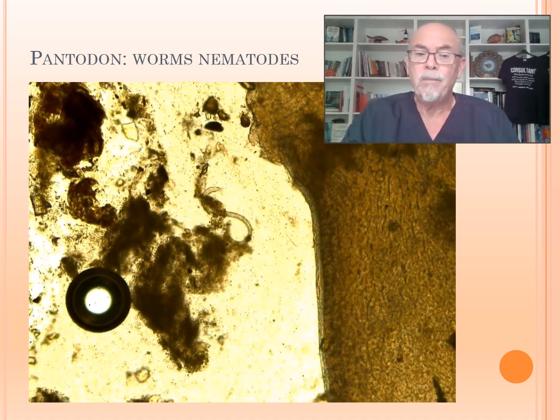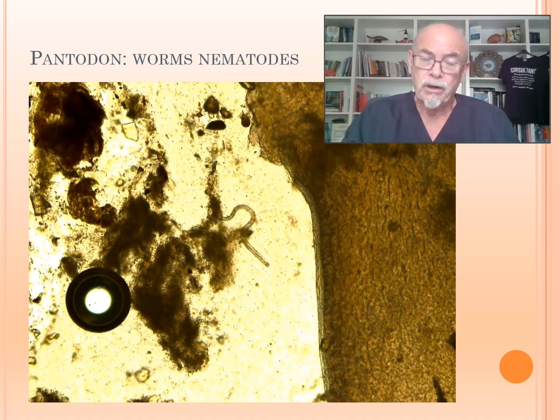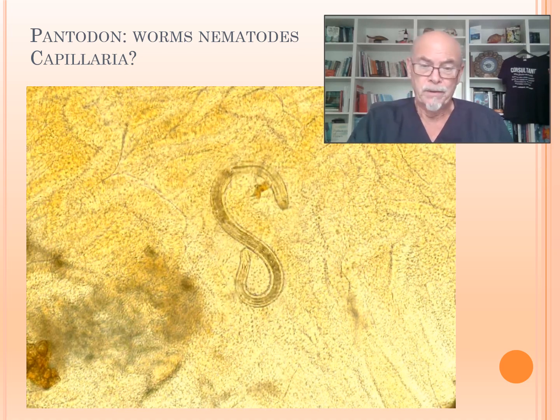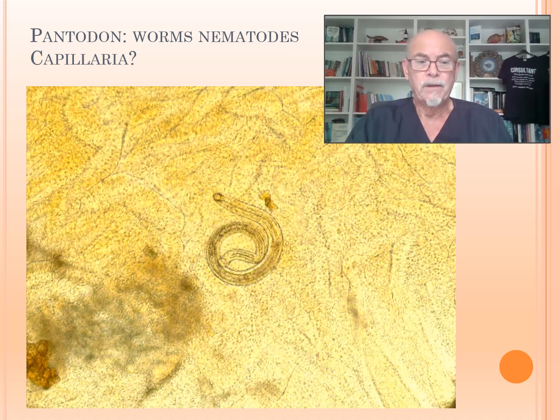Well, free swimming worms, nematodes, well, this might be another reason why the fish is becoming so weak. Here we found another one, and it looks like a type of Capillaria worm. Not 100% sure, but it's how it looks when we look at a head area.